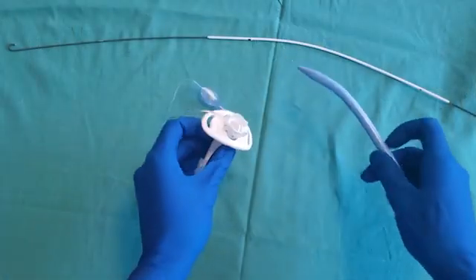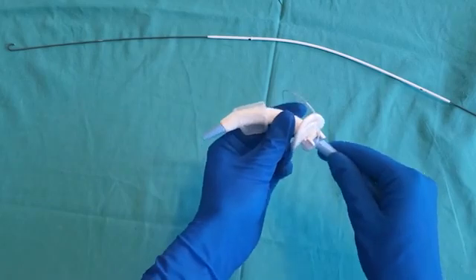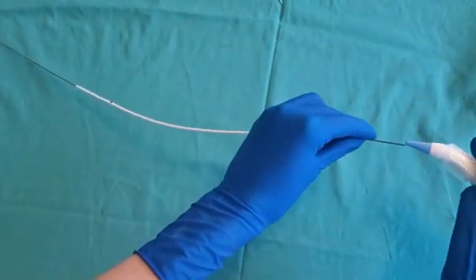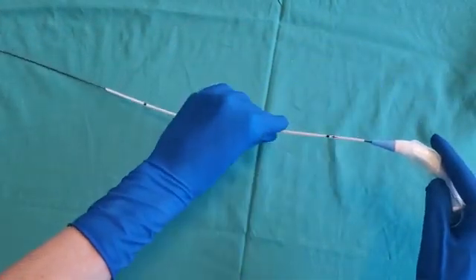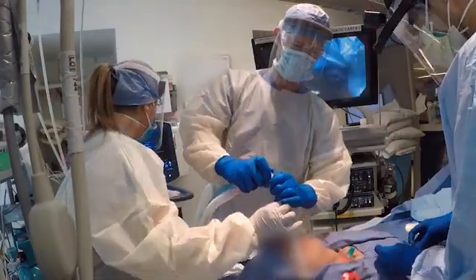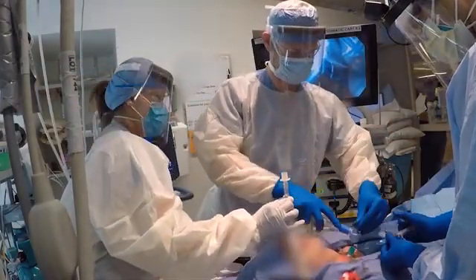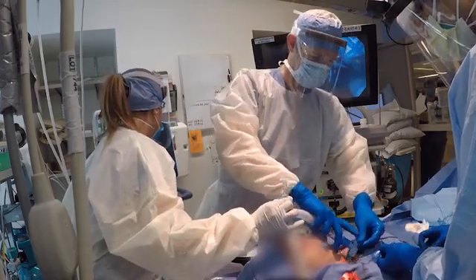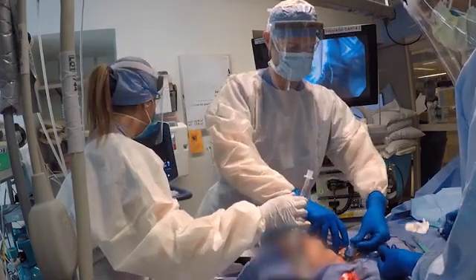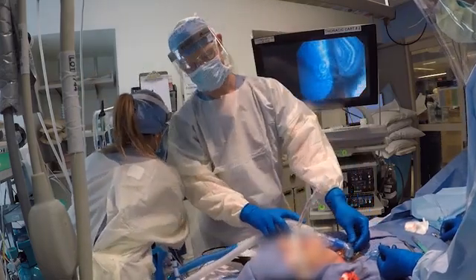Alternatively, a non-flexible tracheostomy tube can be loaded onto an insertion trocar and advanced over the wire and protective sheath into the trachea. Remove the protective sheath, wire, and trocar if used. Inflate the tracheostomy cuff, connect the circuit to the tracheostomy tube, and resume ventilation. The presence of end-tidal carbon dioxide confirms placement in the airway.